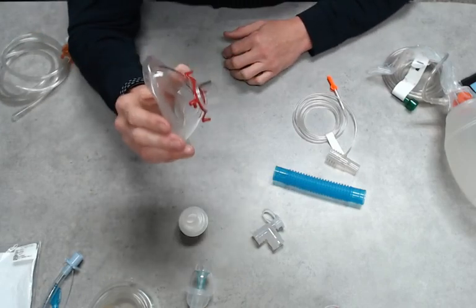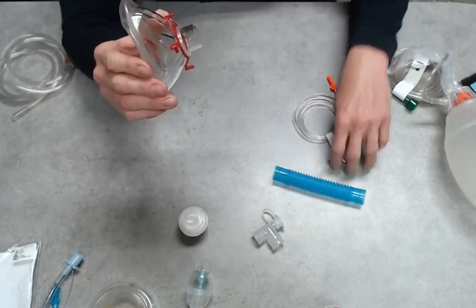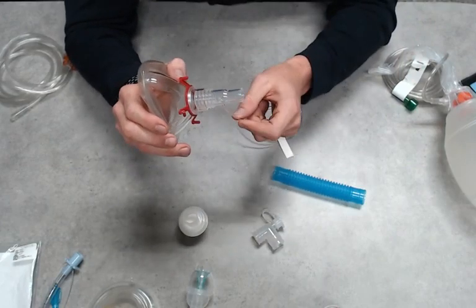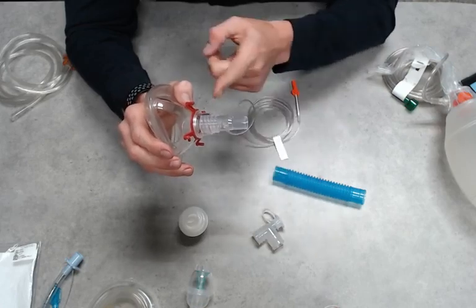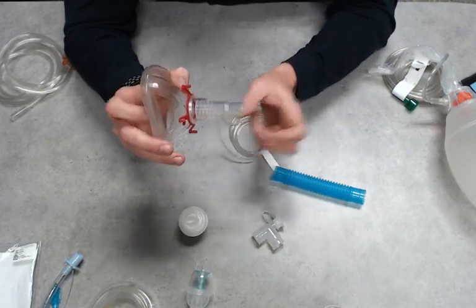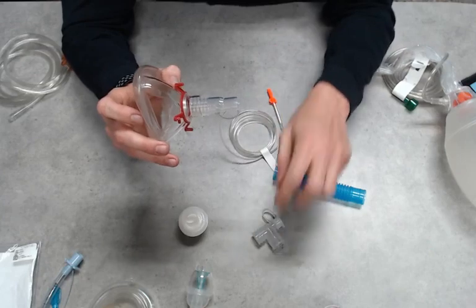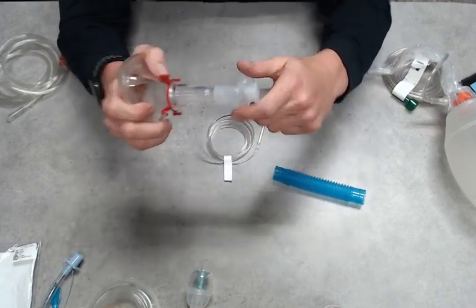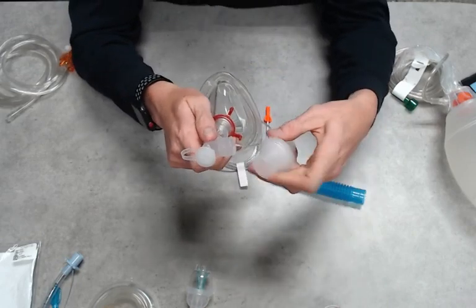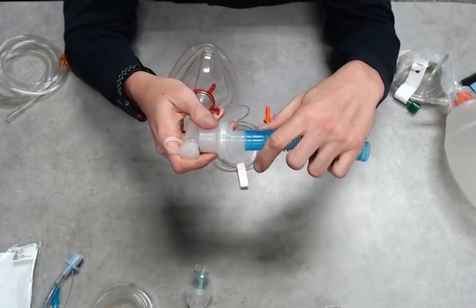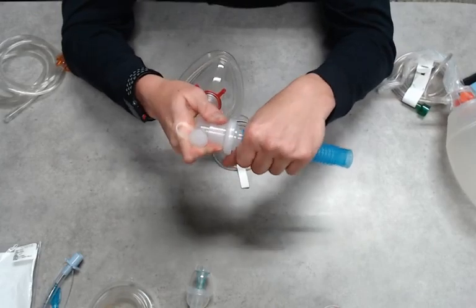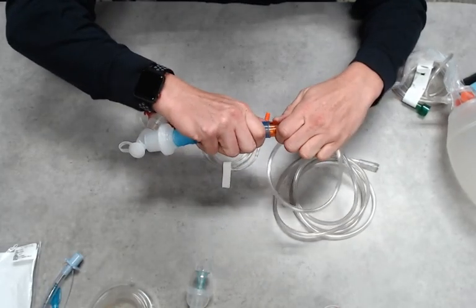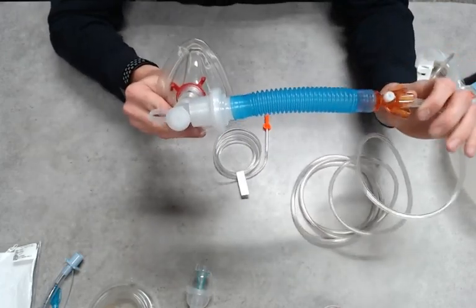So we're going to try to slow down just a second to set this up. We're going to start with our mask. We're going to have our end-tidal. Again, end-tidal should be the first thing that they breathe into, so that will give us the truest reading. Nothing gets scrubbed out throughout the rest of the circuit. So we're going to add the elbow, now we're going to add our filter, flex tubing, nice snug fittings, and then we're going to add our CPAP.